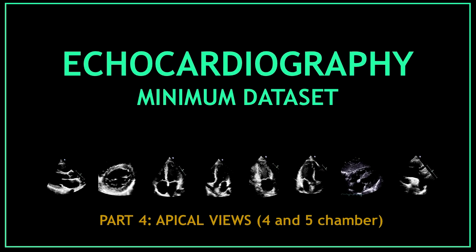This is part 4 of a series of videos about the minimum dataset you need to obtain when you perform an echocardiogram. In this video, I'm going to talk about the apical 4 and 5 chamber views.